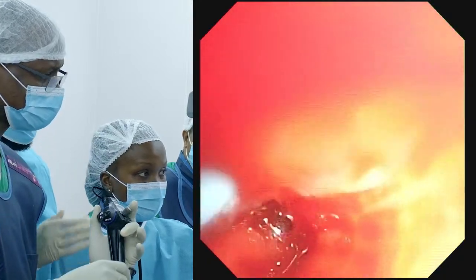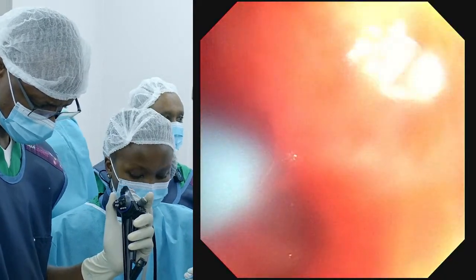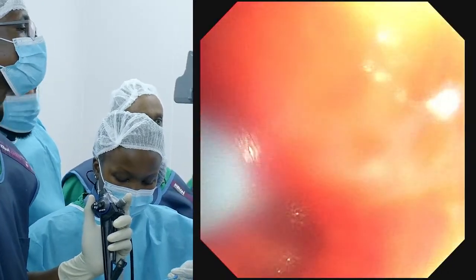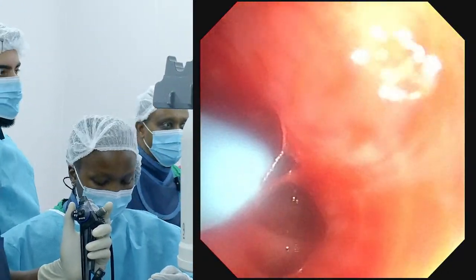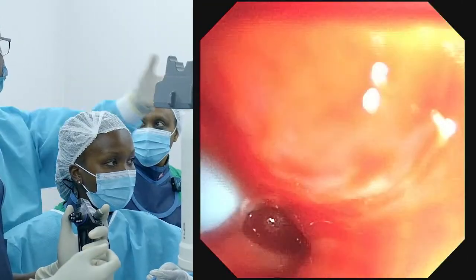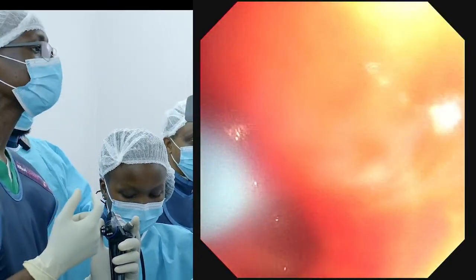It's okay. Once you put the probe in, I'll walk you through it. Fluoro is here. This is continuous and stat image. Continuous is the blue. So I like the continuous. Also, once the probe is out of the scope, with the continuous imaging, you don't really need to look here. Just look at your fluoroscopy and see where your probe is going.